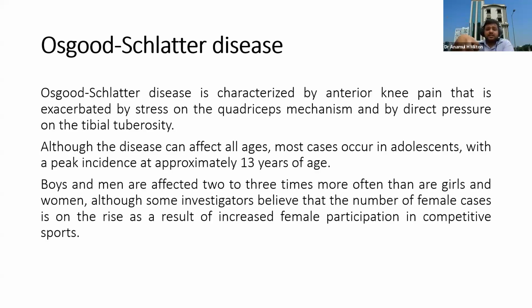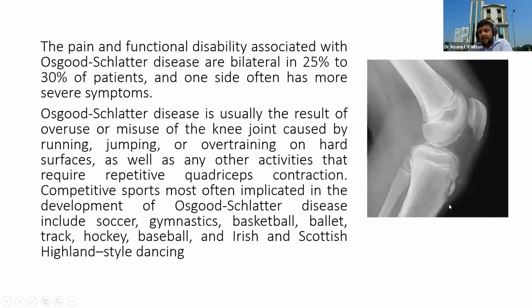So when the patellar tendon pulls hugely on this bony area, sometimes the bony growth or the bony outer cortex is displaced from its normal position to the upside. It looks like a breaking of these things. But never be scared of this.